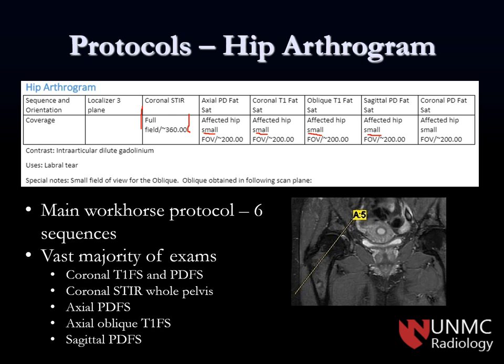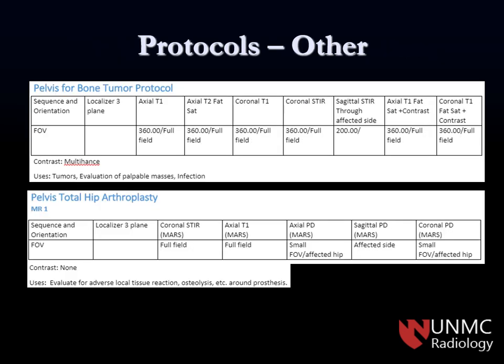One important sequence from the hip arthrogram is the axial oblique, taken through the plane of the femoral neck. Think of it as scrolling up and down through the femoral neck - this is a very helpful sequence to look at cartilage and labrum. We do hip arthrograms most days in the bone room.